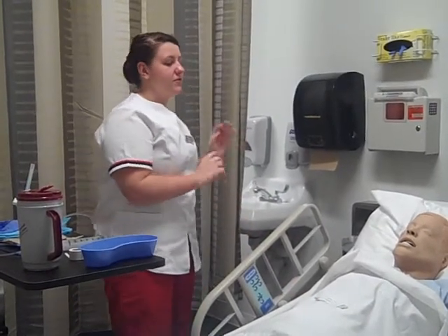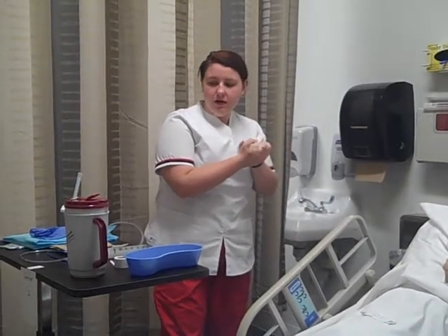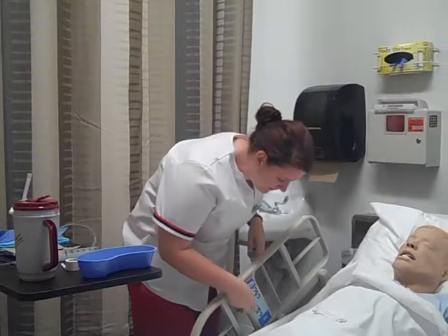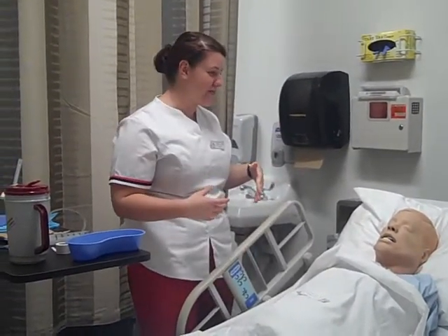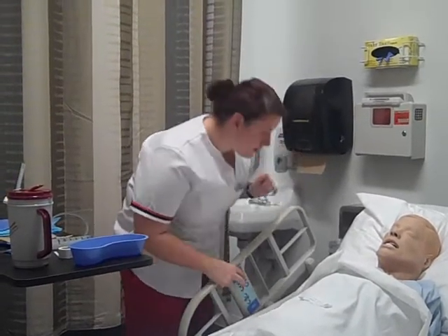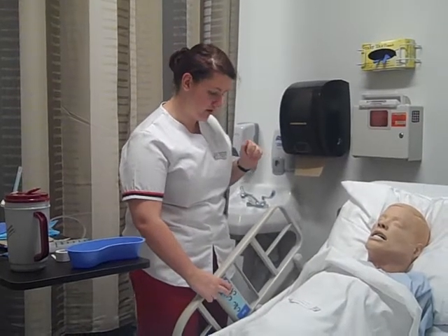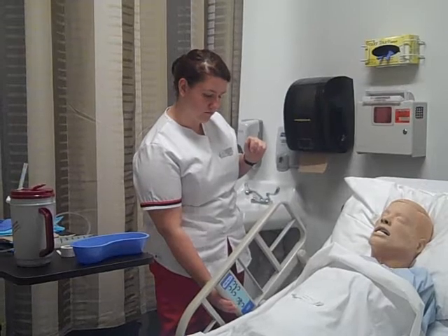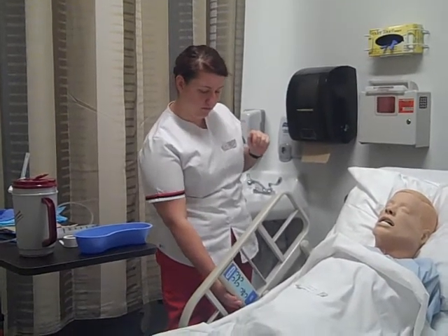Okay, Miss Amy, before we get started, I'm going to wash my hands. And I'm going to raise your bed up so I can work at a comfortable height and raise the head of the bed. Okay, thank you, and now I'm going to raise your bed up.